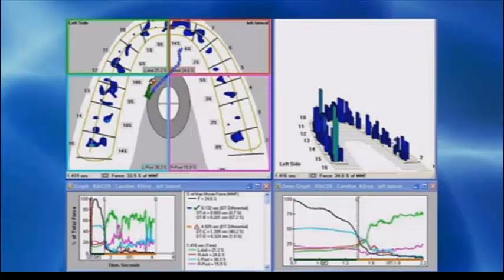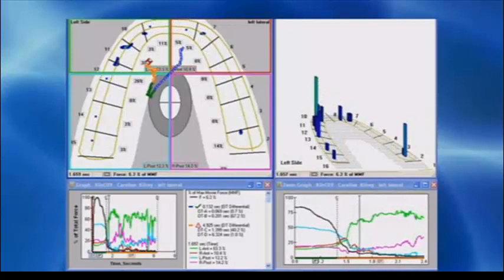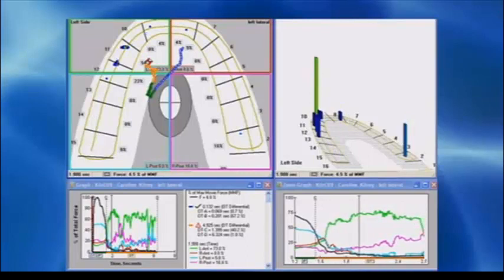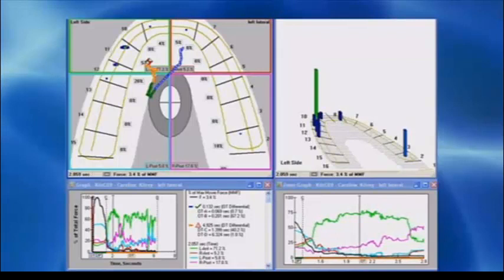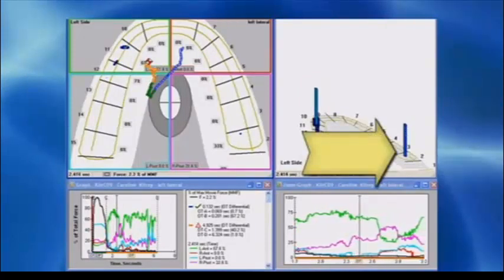And the left one is actually the reverse of the right one, because you have the same dilemma. When you move left, your right side stays together. So going either direction, you do not disengage your back teeth in less than half a second. And so this is what keeps your muscles active. And an optimum goal of occlusal therapy would be to reduce your time of disclusion down to less than half a second. That's an optimum physiologic health goal. And you can see you never get off this tooth. You're consistently on this tooth.